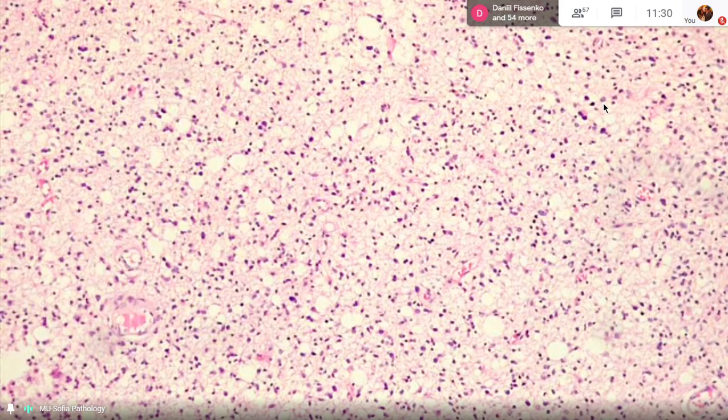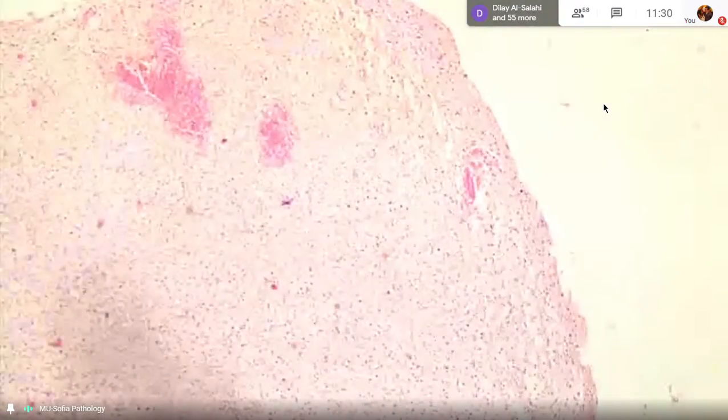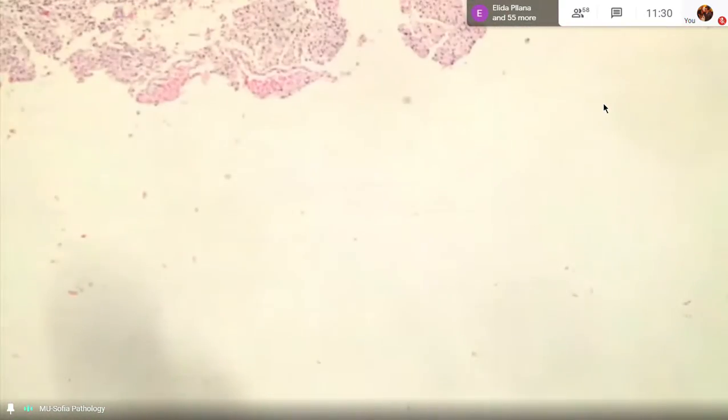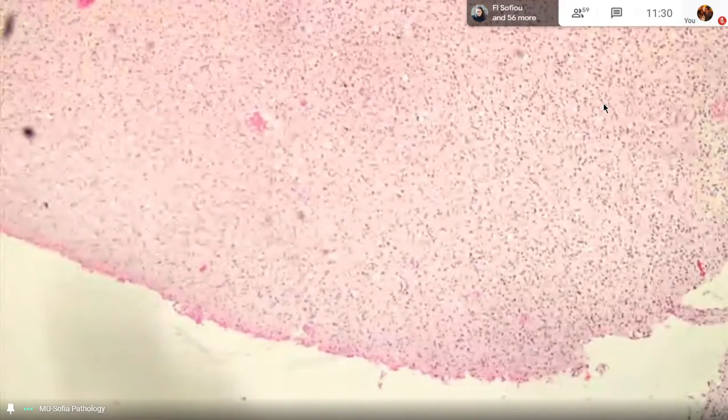And looking at the periphery, if you can see it, I don't know whether we have normal brain tissue here or it's just tumor tissue. It has a little bit of an infiltrative pattern. So one of the problems is to properly locate the tumor so that the whole tumor is removed. In this particular slide, there are some alarming features, but we'll discuss them on glioblastoma multiforme.